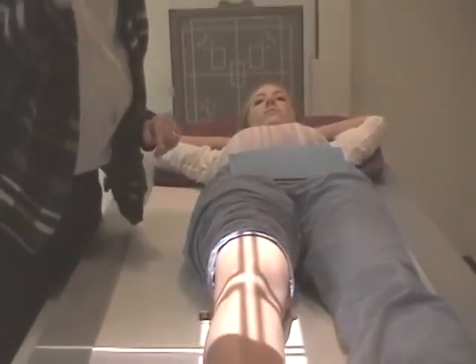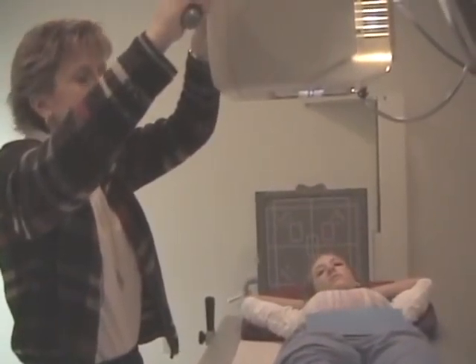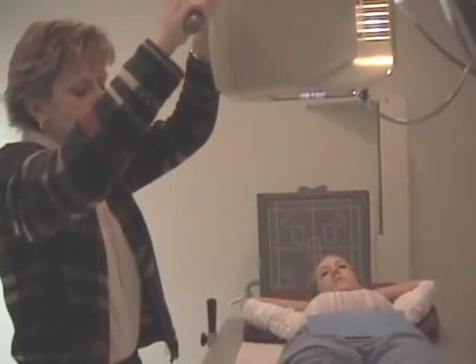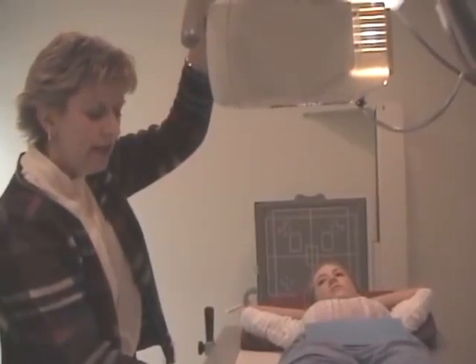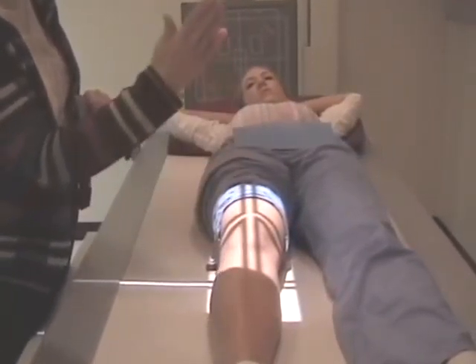Now, if you are angling the tube, either caudal or cephalic, we're going to put a 5-degree cephalic tube angle on there. Notice how I didn't move her, didn't move the tube, I only put an angle on, and see how it's entering high? That's because we've taken a perpendicular beam and now we're angling cephalic. I'm going to have to readjust the tube.